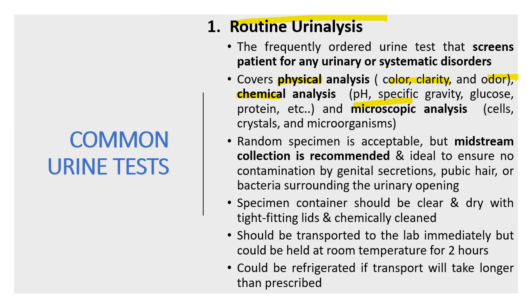Ano dapat yung specimen pag routine urinalysis? We have midstream, clean catch collection. Bakit? To ensure that there is no contamination. Tapos, the specimen container should be clear and dry. Tapos, it should be transported to the lab within ilan? 2 hours.